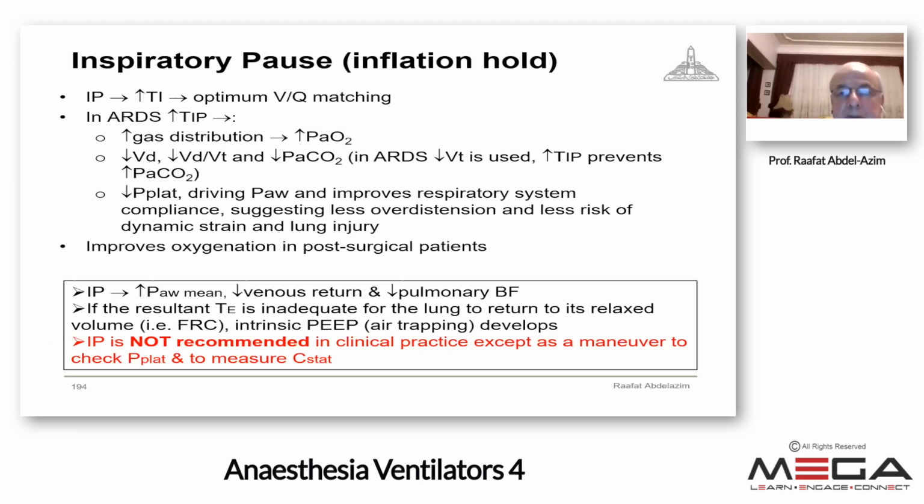If it is not visible and you want to measure the plateau pressure to monitor a patient who is changing compliance, you create a pause by pressing the inspiratory hold or pause button and adjusting its duration or its percent to 10, 20, 30% to see it, see the value and the duration. Now you can know the plateau pressure and you can calculate the compliance.